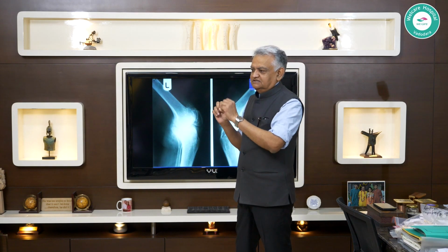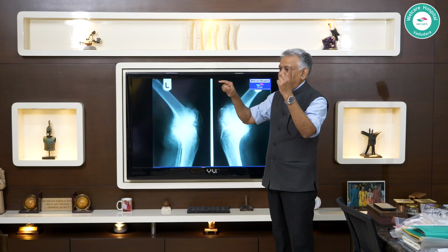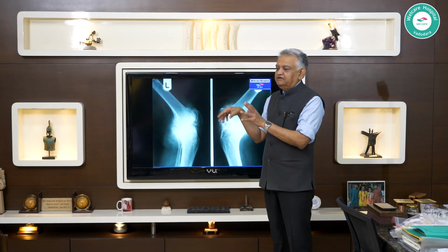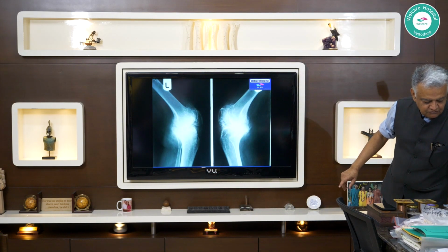First you told the navigation what is space. So this is your space. Within that space, you told that navigation thing, by virtue of that optical sensor, that data is transferred there, that these points which I have just registered in this space, in this room, one point here, here, and now there is an algorithm that I give you, say, 200 points, you yourself now conjure up the intervening points. So it is important to understand how navigation works.